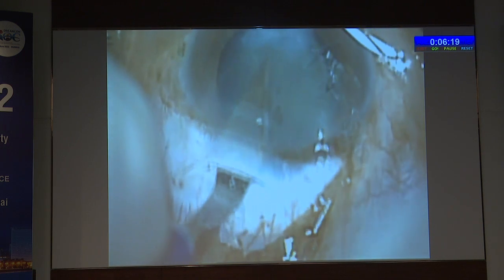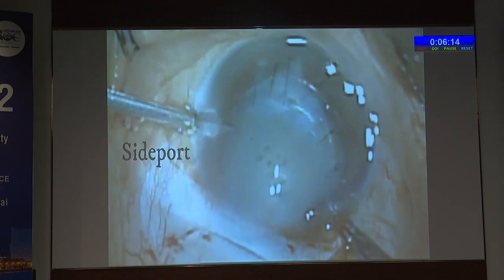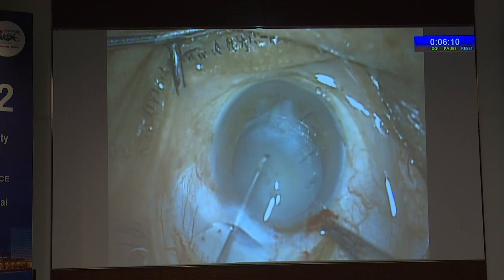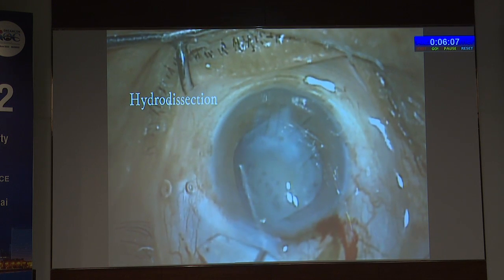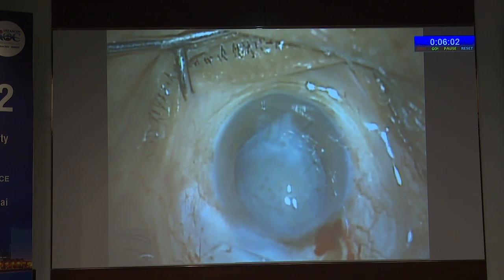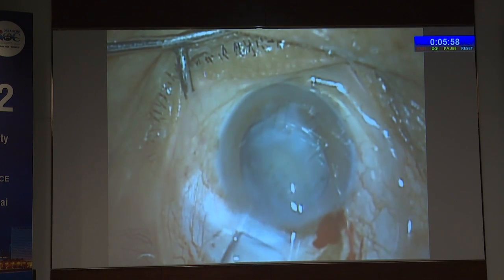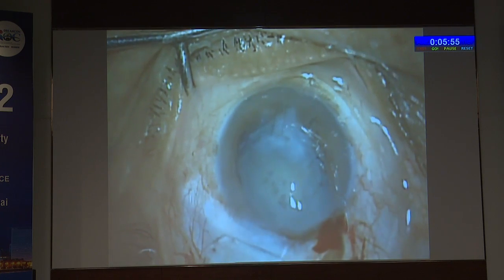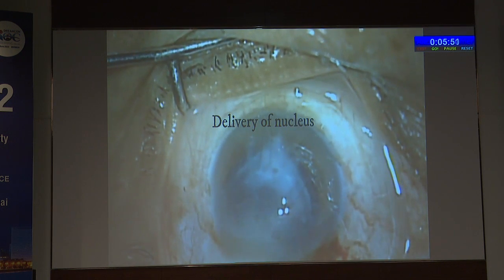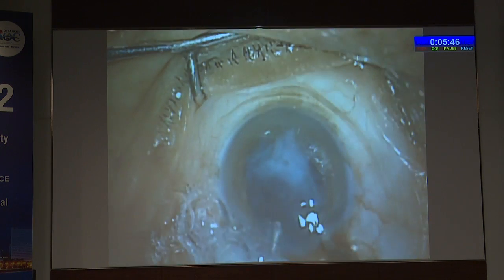you can definitely manage this cataract with any type of the things that is in your hand and where you are well conversant. Now this is the traumatic cataract, and then after doing the rexis, can you see this? Whenever I am trying to do the rexis, the nucleus is rotating, and this nucleus is brought in the anterior chamber, and then this is just delivered by the SICS.